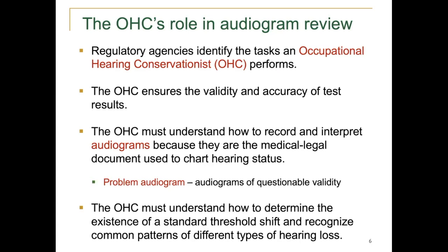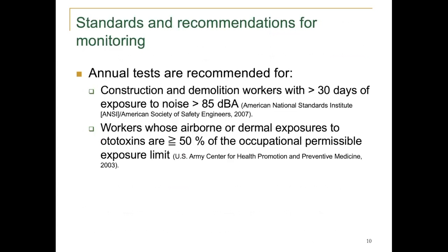The OHC is also responsible for referring problem audiograms to the professional supervisor, who is an audiologist or a physician. The OHC must understand how to determine the existence of a standard threshold shift and recognize common patterns of different types of hearing loss.